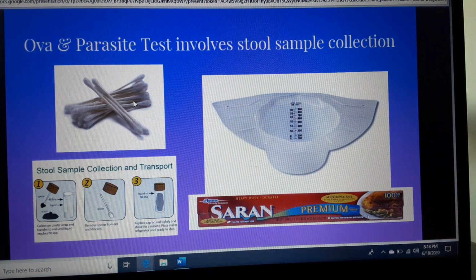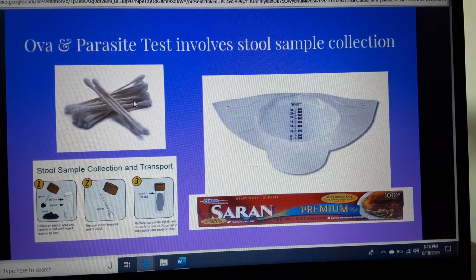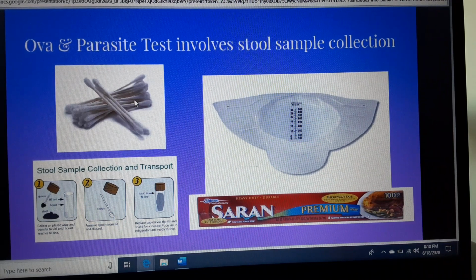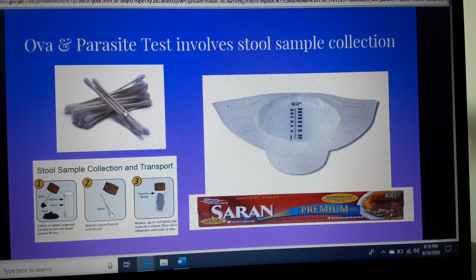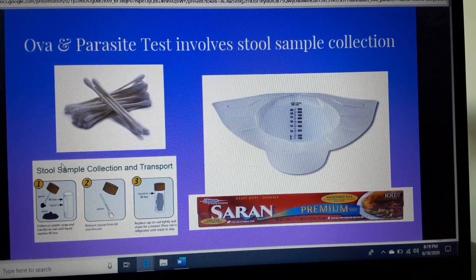All of these helminthic infections can be diagnosed with stool samples. Some may require more than one sample, and others, such as pinworm, may be easier to diagnose using tape. The stool sample must be as undiluted as possible to increase the possibility of eggs being found. A fecal sample should be placed into a specimen container after acquiring it. There are a variety of different methods for gathering stool. It can come from a child's diaper, a hat, or saran wrap put over the toilet. Whatever the method, try not to have it mixed with urine.